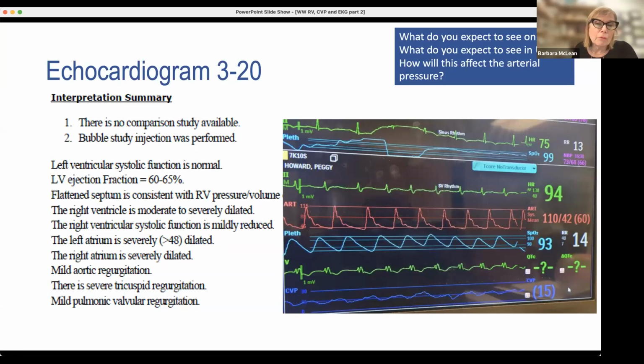Okay. Is our bag at 300? Are we level? Do we have any air in the tubing? You set it up really quickly. Ask all those questions. The answer is, oh, we've done everything right. We've done everything right. Want to remind you here that we have this very damp looking waveform, but let me tell you why.